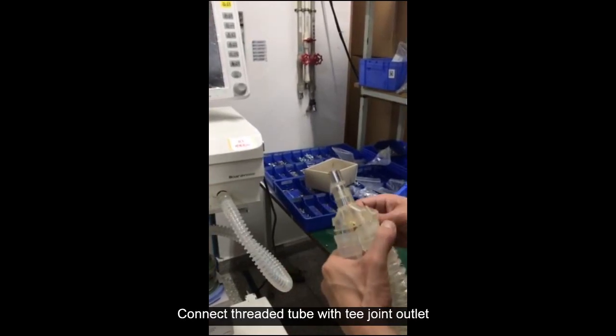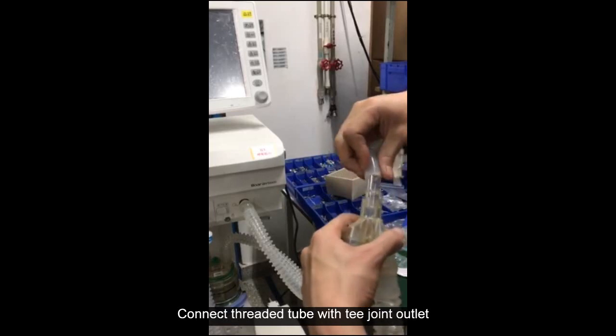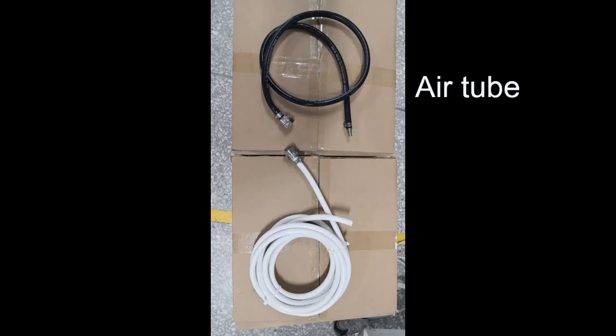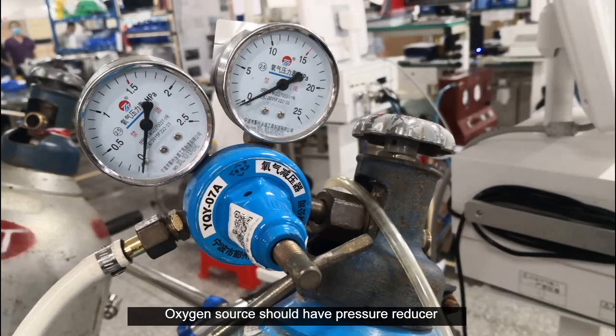Connect the threaded tube with the T joint outlet. The oxygen source should have a pressure reducer installed.